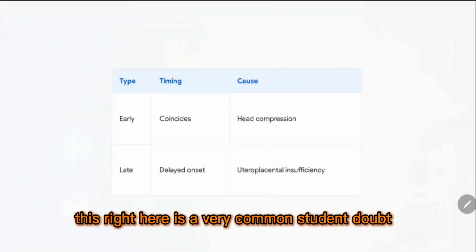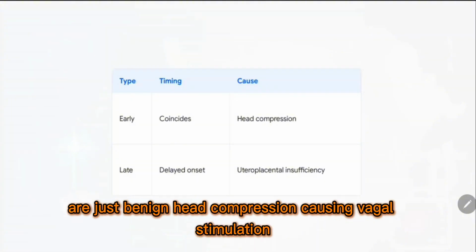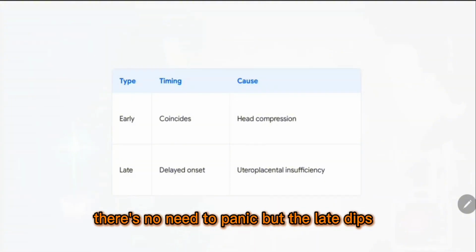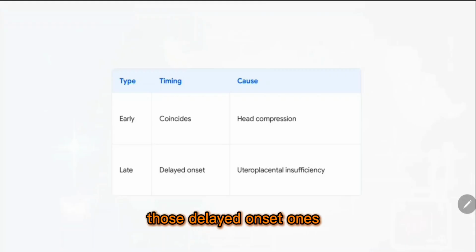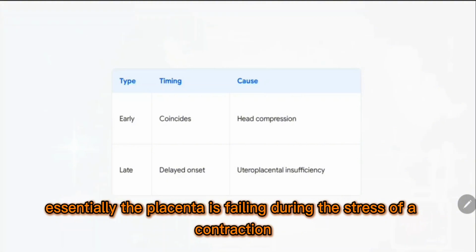This right here is a very common student doubt. Those early dips, the mirror images we just talked about, are just benign head compression causing vagal stimulation. There's no need to panic. But the late dips, those delayed onset ones, they signal ominous uteroplacental insufficiency. Essentially, the placenta is failing during the stress of a contraction.